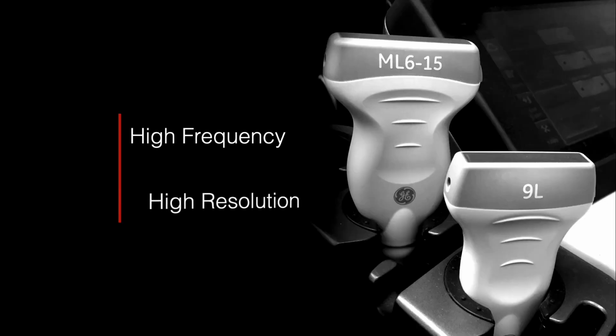A couple things here as we work through actually getting the ultrasound done. We're going to want to select the transducer that's going to give us the highest resolution we can possibly get. That's going to be our linear transducers, a high frequency transducer. That high frequency translates into high resolution. And since all the structures that we're looking at are skin deep, in the subcutaneous tissue, it's generally not going to be much more than 4 or 5 centimeters total depth. The high frequency linear transducer can really be our ally here and give us that resolution that we want, because we really don't need the penetration depth, right?